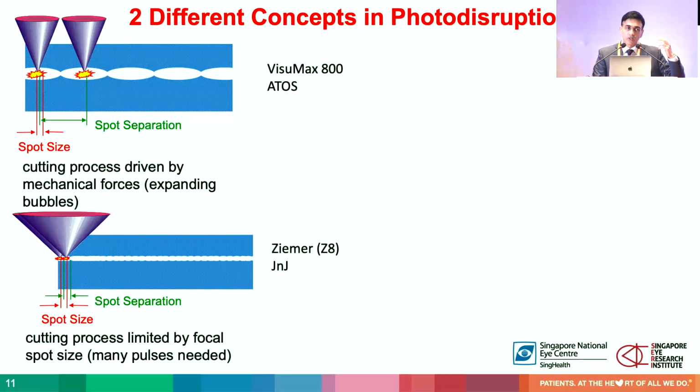Okay, so physics is not the same as biology, and it's important to understand the effect on the tissue, as opposed to the effect of a mass itself when you're using pure mathematics. And in JCRS in January, I wrote an editorial with Holger to talk about this in a bit more detail. The other thing to understand is that lasers use nonlinear absorption.